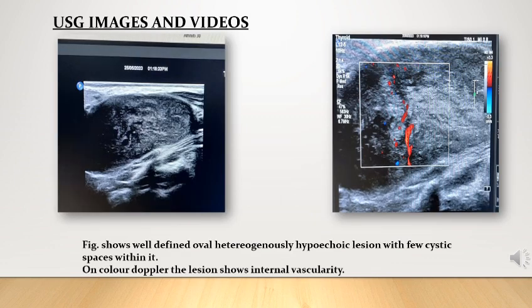Images in the slide show a well-defined oval heterogeneous hypoechoic lesion with few cystic spaces within it. On color Doppler, the lesion shows internal vascularity within it.